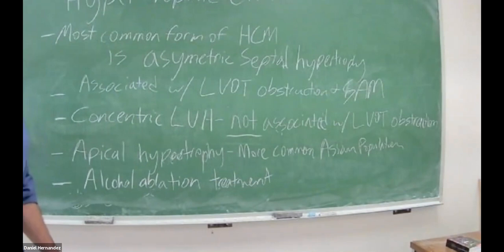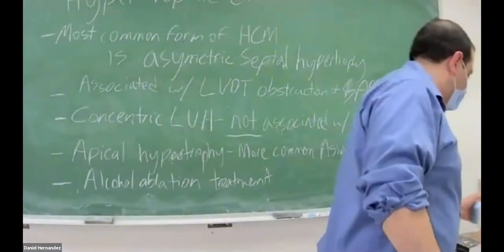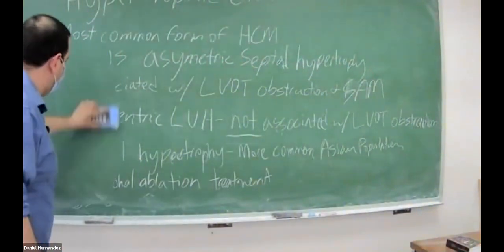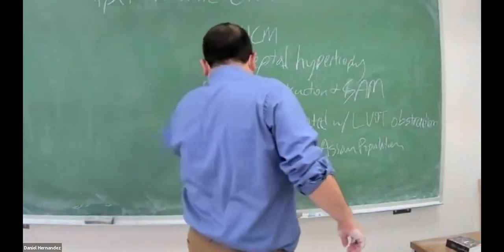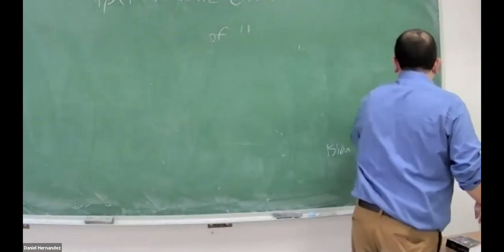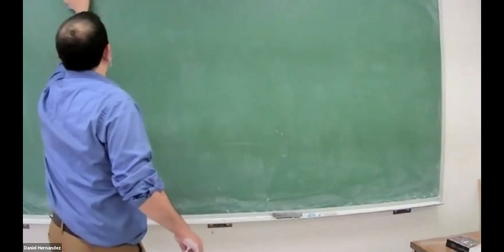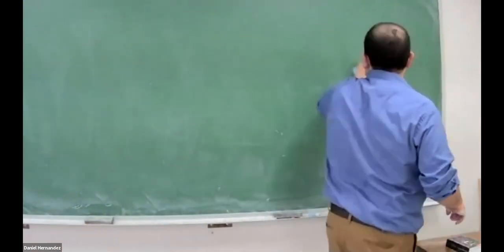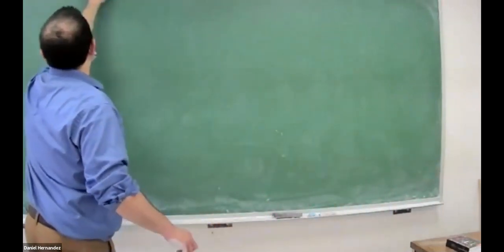Then we know for our dilated cardiomyopathy, that's going to be our big dilated leaky heart. Some key terms associated with dilated cardiomyopathy is that the heart begins to take on a more spherical shape. That's why we have that spherical index calculation that some labs will do.